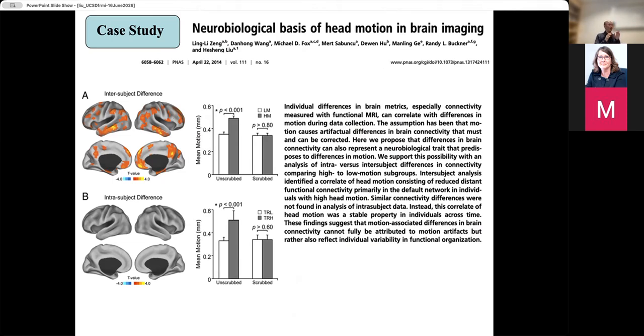Let's just assume that they try to match things as well as possible. Okay. I don't know the details. I don't remember the details. It probably had an FD block, is my guess, a precision level rather than the same. But they might have tried to keep the time points equalized, like reduced. You could always take the low motion group and say, I'm going to only take this many time points. Let's assume they did the right thing.